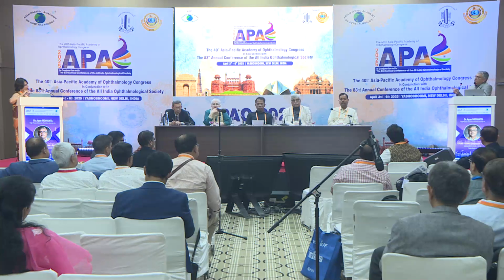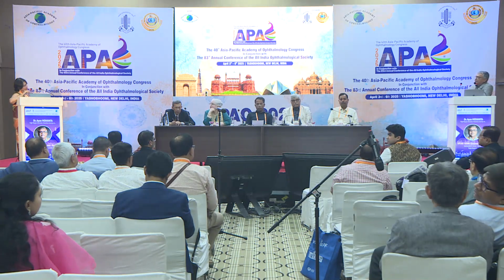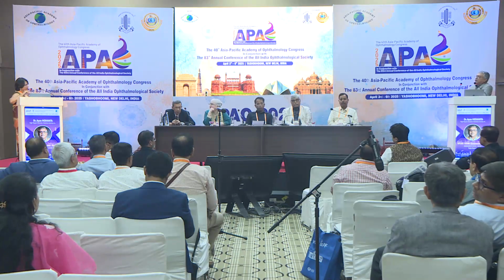And do you always target -1 or -1.5 for all types of myopia, or is it with higher myopia? No, only with macular pathologies. Otherwise, minus 0.5 to 0.75 is fair enough. So it's near emmetropia.